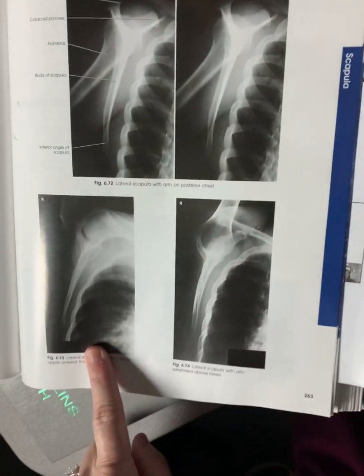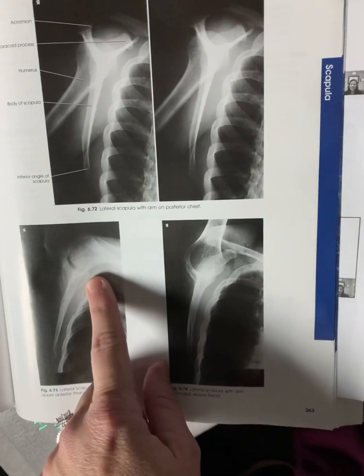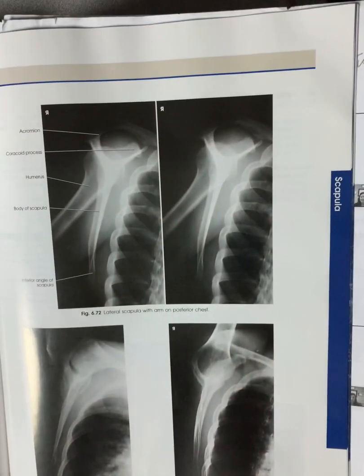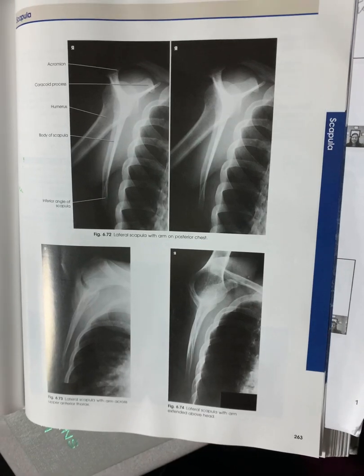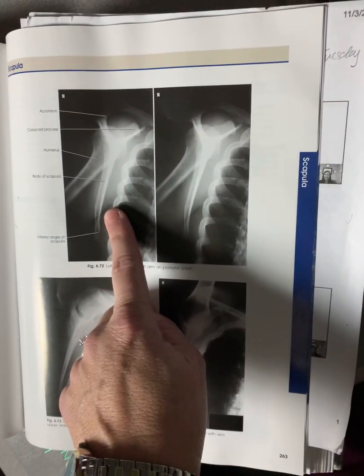Down here, this is done with the arm across the anterior chest. Is it as easy to see the coracoid and the acromion as it is up here? Mm-hmm. It's not, is it? Keep that in mind. You see a lot of techs doing that, just taking the arm and coming across the chest like that. But to me, it's just not as pretty as that arm behind the back.